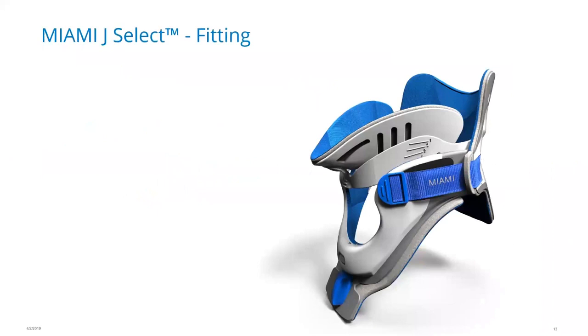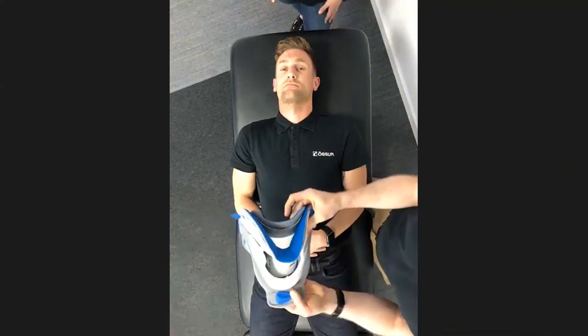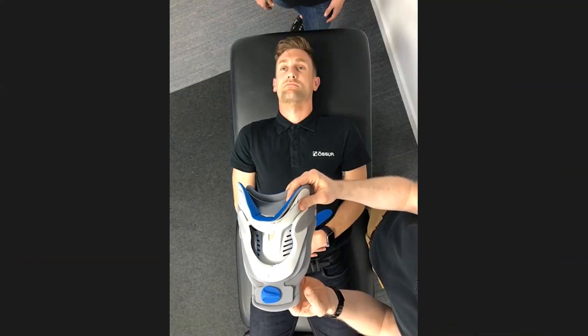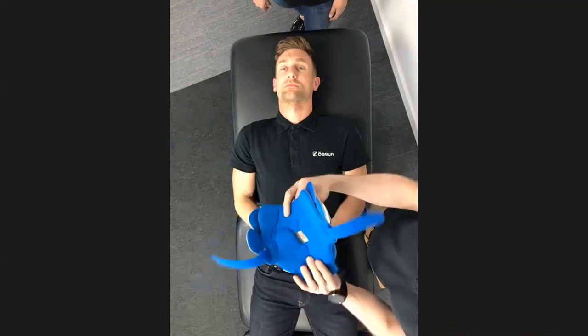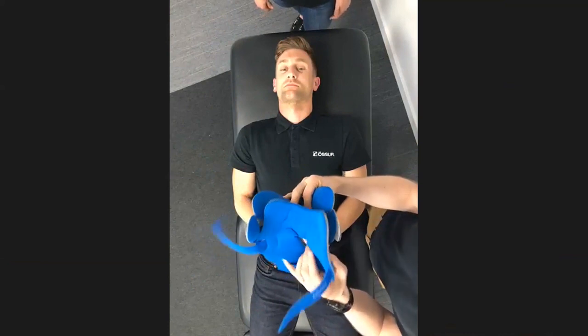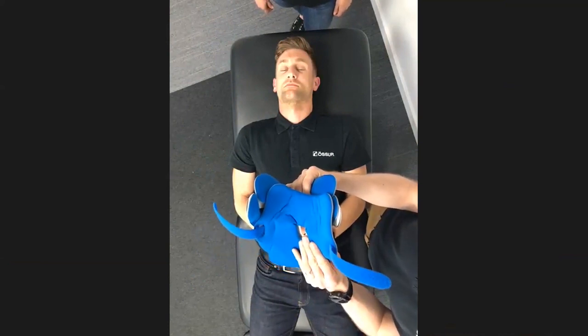So I'm just going to go through a quick fitting. We're not going to go through correct spinal protocol. It's important that this is actually done locally at your individual hospital. And you can see that we've got 2 sections here. So this is the standard Miami Select. You can also order these with extra pads if needed. So it comes with a set fitted, but you can order an extra set depending on your need.